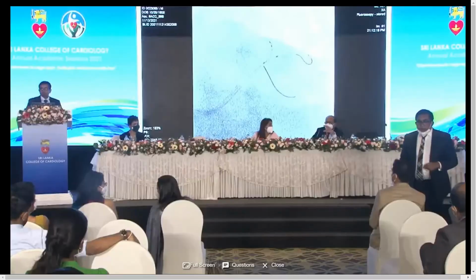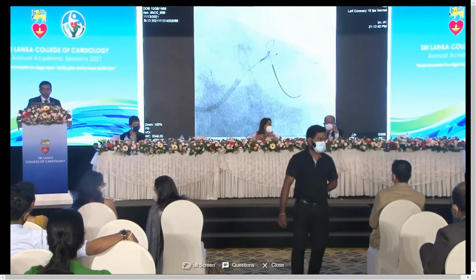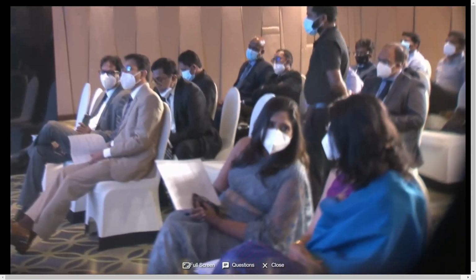covers both sides of the side branch if you put it distal and bring that part of the strut towards the wall. So it covers both sides. So it's a must. Now I think you should do more and more cases. This is why experience is going to make it easier when you're trying to do the bifurcation two-stent strategy.